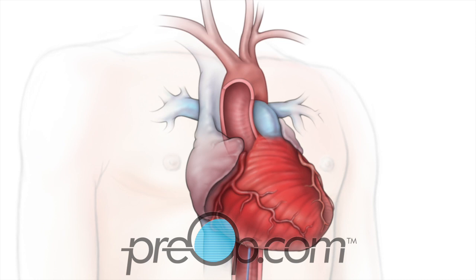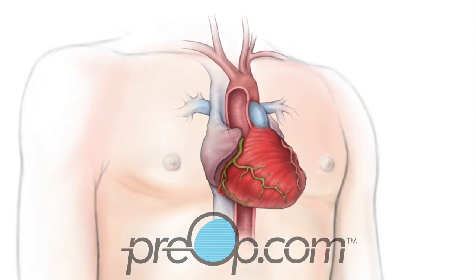The long catheter is threaded through the guide in your artery up to your heart. Dye is given through the catheter and the x-ray camera is used to see it flow through the heart. The arteries that feed oxygen to your heart, the inside walls, and the shape of your heart are examined.